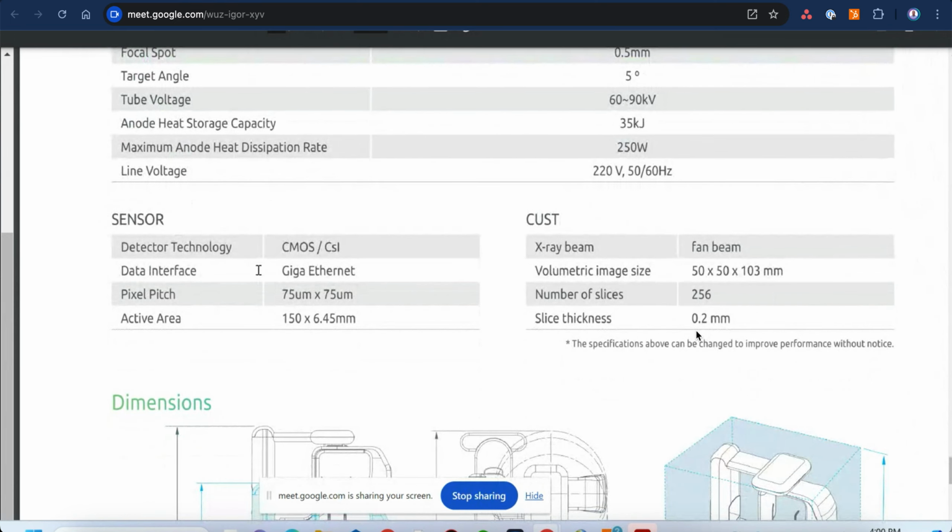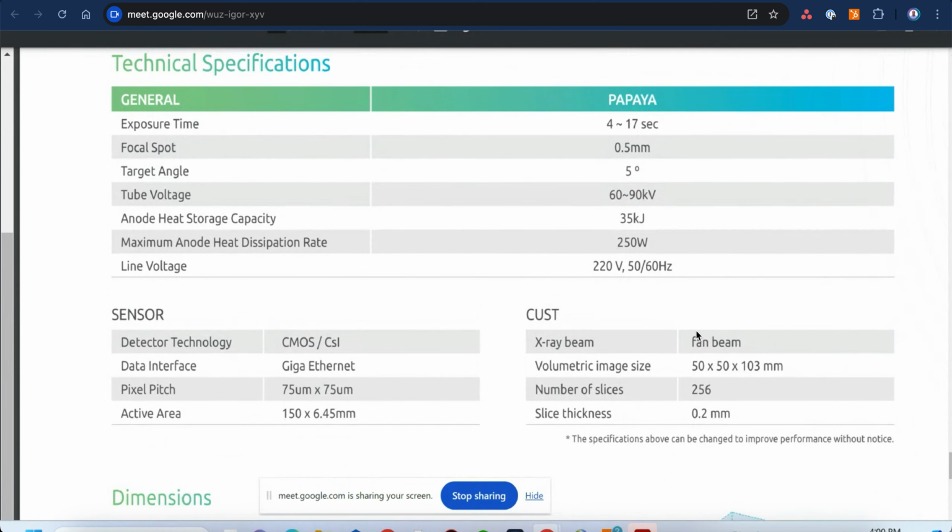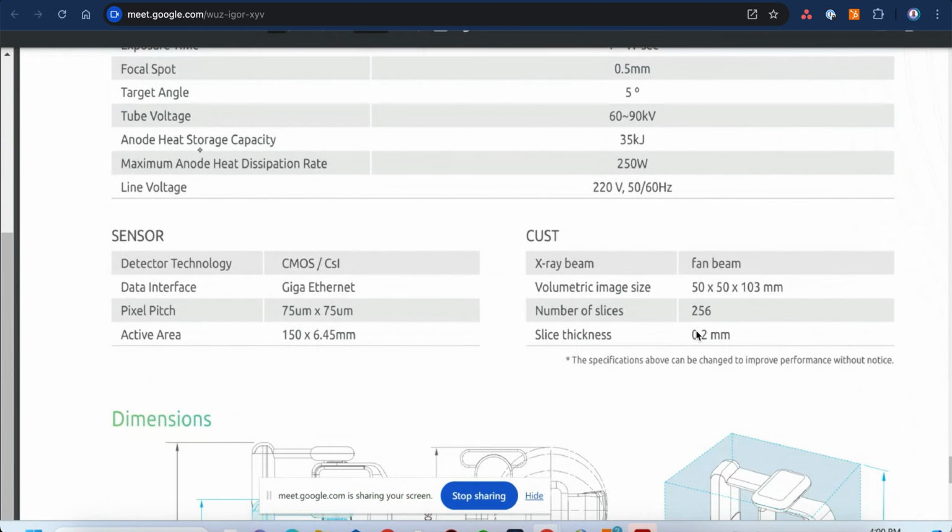Can I interject and explain about the focal spot a little bit, because it is really one of the selling points of X-ray equipment. When you tell the dentist it has a focal point of 0.5, it's better than 0.8. That means to him it will be high definition, high resolution images, and he'll be able to see the images much clearer. That is a good selling point, because other companies will have a larger focal spot for the same price, but then you have to compare the definition. If the dentist knows that he's going to get better resolution for the same price, he will go for it. It's just the sales technique.